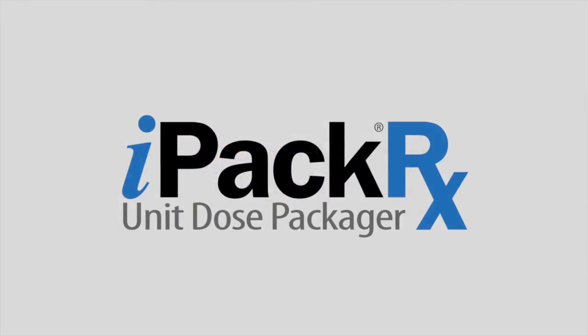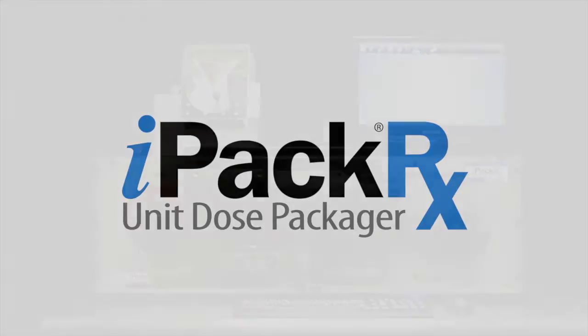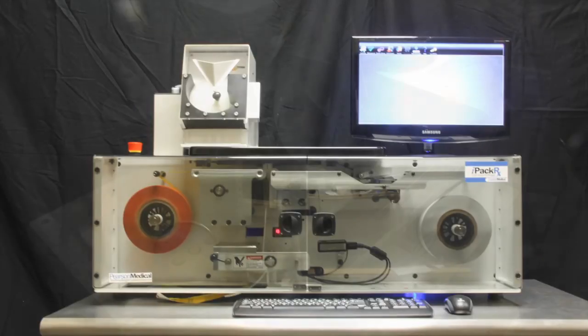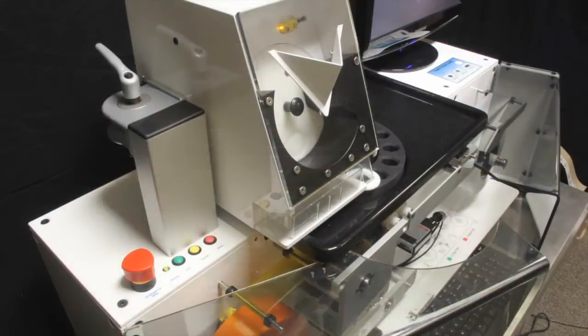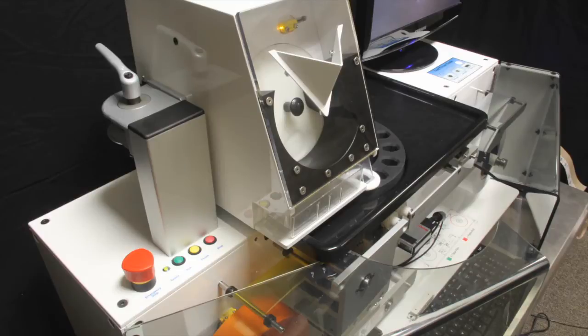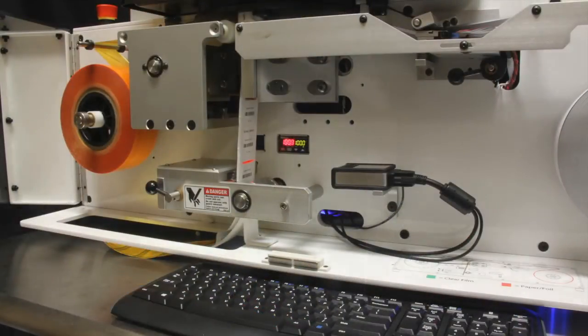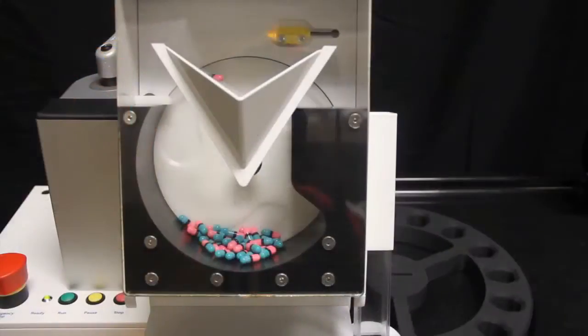Pearson Medical Technologies is proud to present the IPAC-RX Unit Dose Strip Packager. This tabletop system is designed to be a complete unit dose packaging system to help your hospital meet the new regulations from the Centers for Medicare and Medicaid Services that mandate barcoding as a component to achieve meaningful use of electronic records.